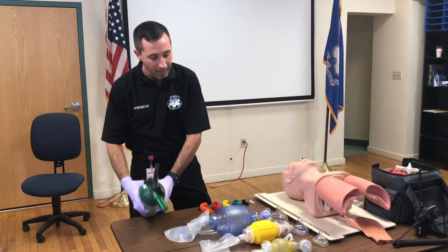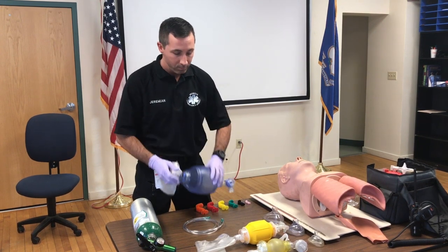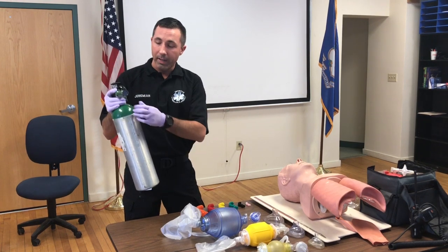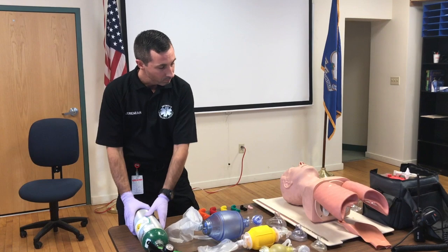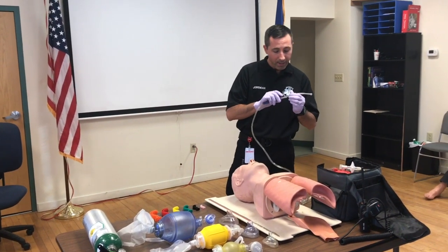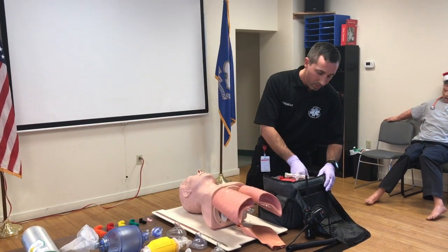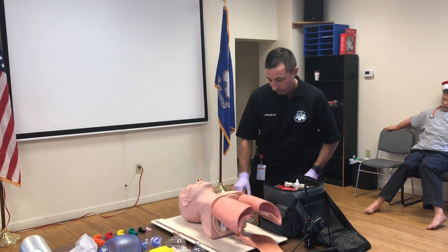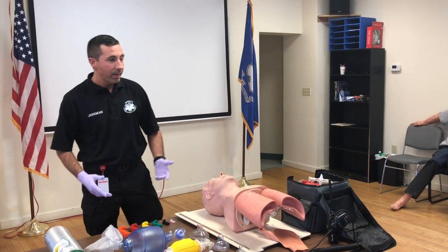I also want to look at the bag valve mask. I want to make sure that I know where I'm going to connect the tubing. Look at the stem on the regulator going back to the O2 tank. You want to make sure you know where the oxygen comes out. When you get to your suction device, take a look at the catheter. See if it has a hole in it where you would initiate suction. Make sure it's a rigid tip catheter. And you also want to look to see where your power button is. All right, so I'm familiar with my equipment. Believe I have everything I need.